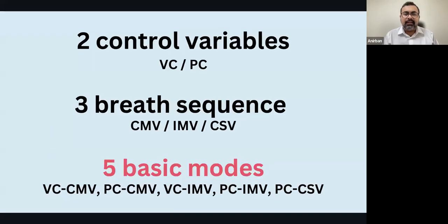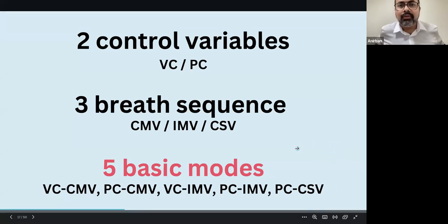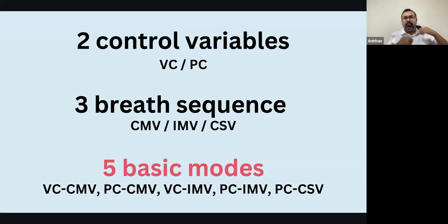So it is a good exercise that whenever you have a ventilator you are not familiar with, you look at the ventilator's settings and waveforms and try to classify it amongst these modes. This exercise will lead to greater understanding of the ventilator modes.